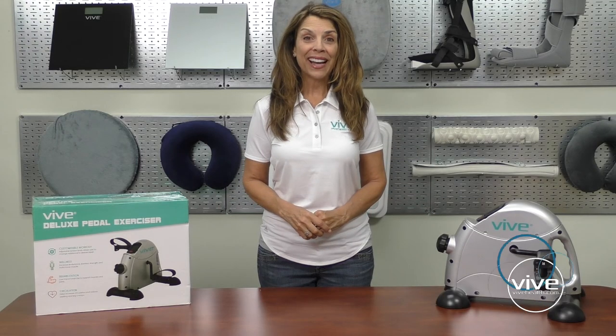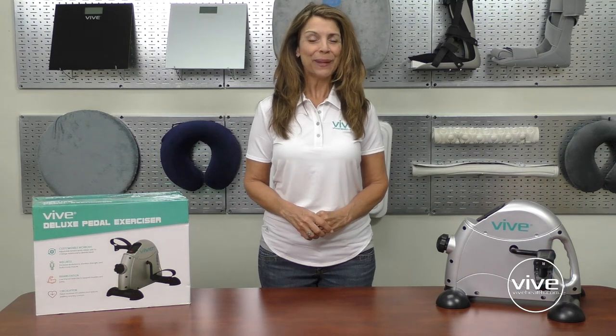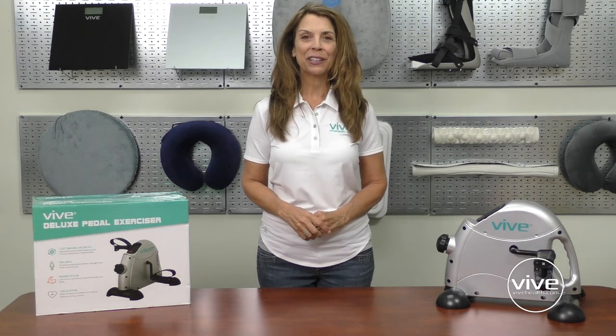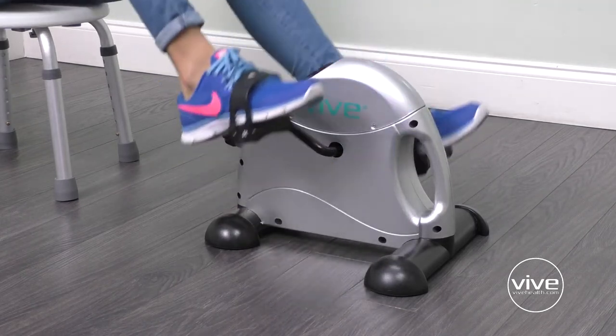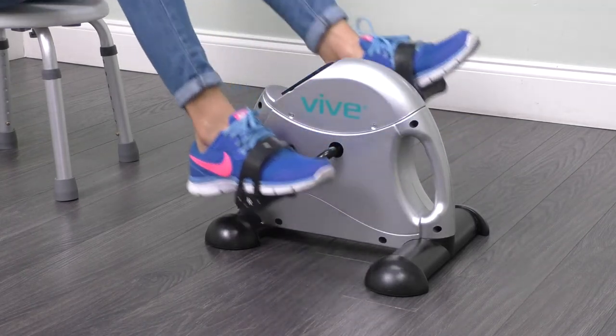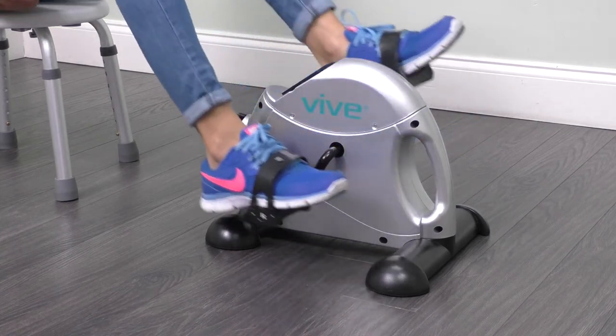Hi, I'm Karen from vivehealth.com. The Vive Pedal Exerciser lets you get a low-impact rehabilitating workout in, no matter where you are. Use it at home, under your desk at work, or anywhere in between.